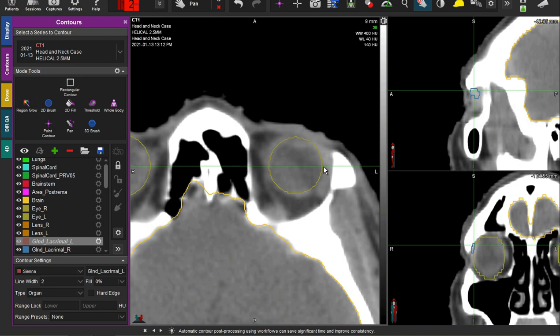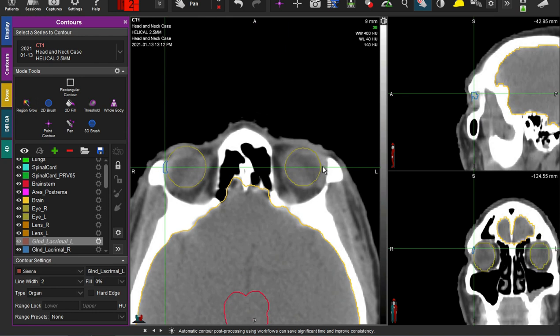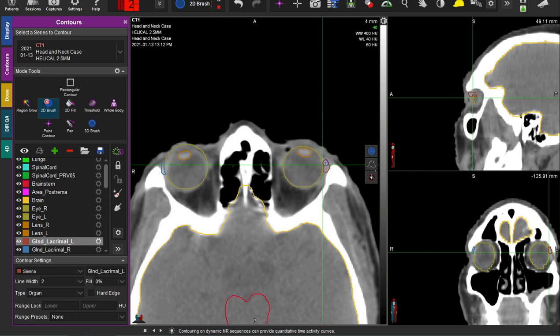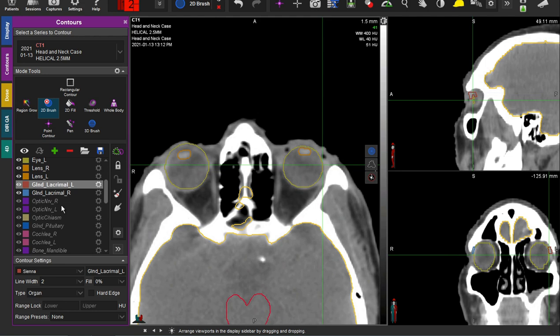We will move to the left lacrimal gland. You can have both sides visible for reference so you can get a sense — okay, my right one is there, maybe my left one starts here. It's the space just lateral to the eye, to the orbit.